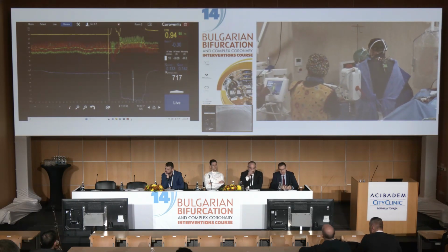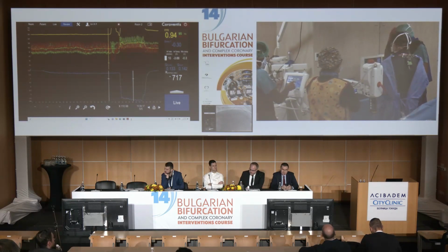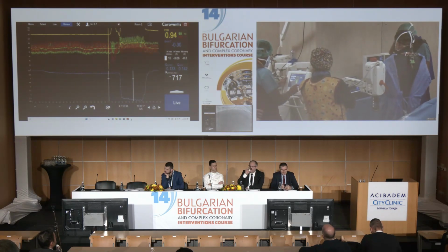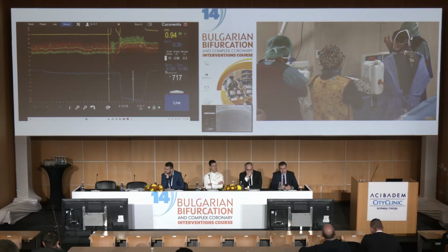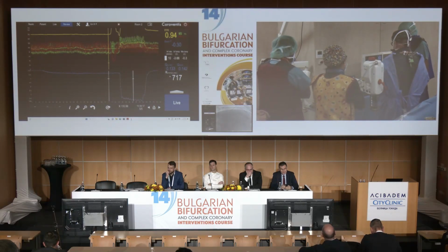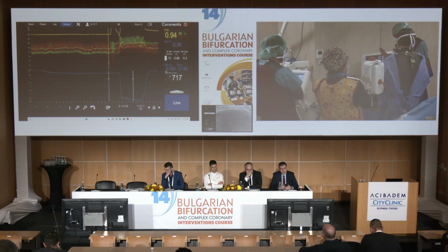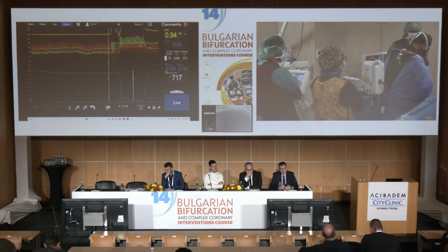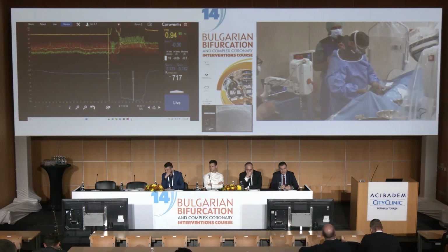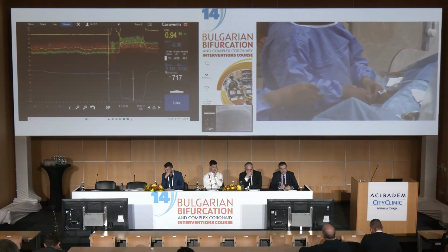Resistance 717 Woods units. You remember the good old Woods units in the pulmonary circulation? Well, these are the same Woods units, except much, much higher because the flow is lower. And you are going to say, yeah, but so what? Resistance, flow, you told us this morning, this is influenced by the mass. Fully agree. But this is at least what we have addressed. And this is the reason why I will ask Valérie to go back with the wire, endoscopy please for the demonstration, to the distal part.